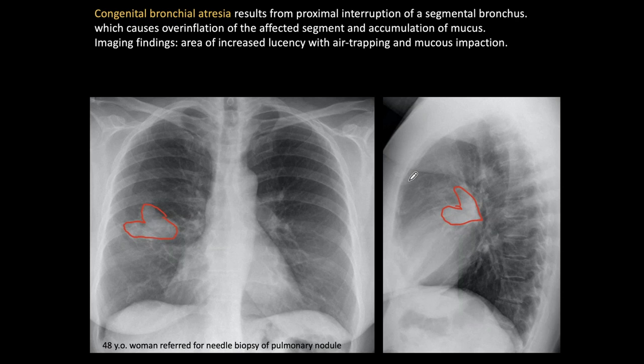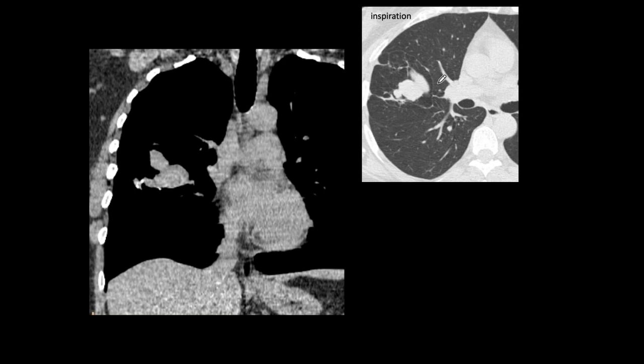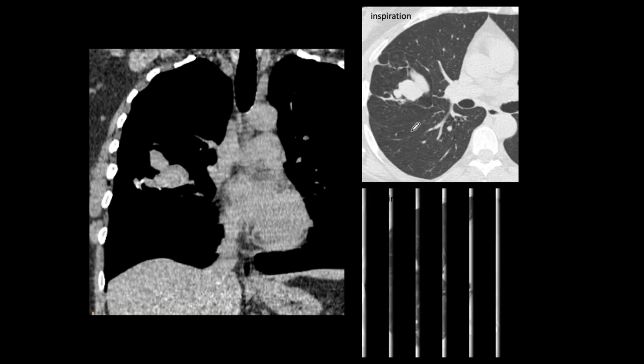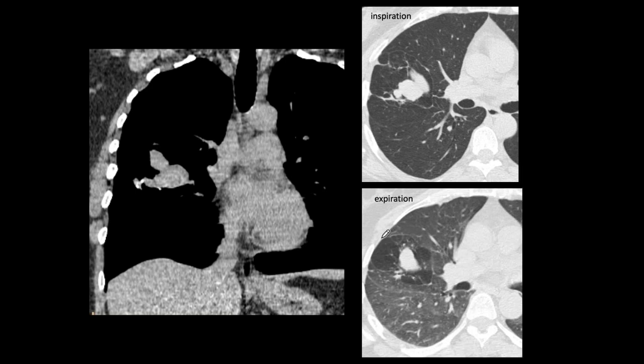The same typical mucus impaction appearance is seen on the lateral view. Therefore this apparent nodule was not biopsied — instead a CT was done. On CT the mucus impaction is confirmed with calcification, which is common in mucus. In the lung window on the inspiration view we see a hyperlucent lesion with mucus impaction inside, and on the expiration view we see air trapping with increased lucency and the mucus impaction in the center. This is practically pathognomonic of congenital bronchial atresia.